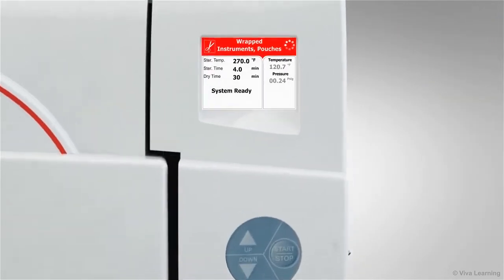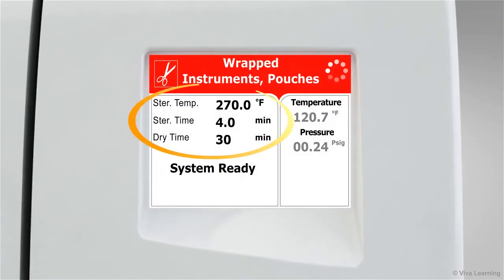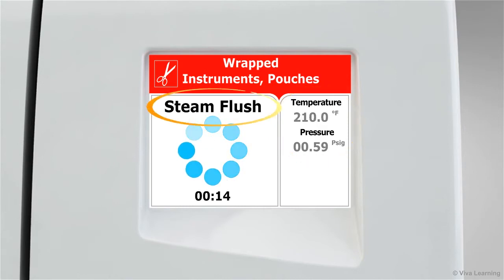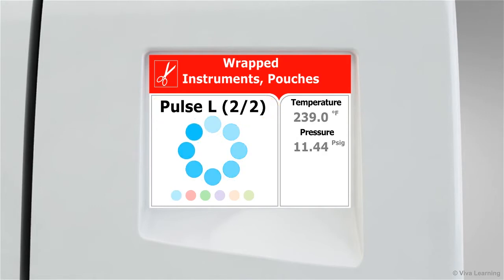All of the program parameters, including sterilization time, temperature, and drying time, will be displayed. Then, when the program is running, keep an eye on the display panel. The actual temperature and pressure in the chamber, as well as the current stage of the sterilization cycle, will all be clearly indicated. And, with each stage represented by a different color, it's even easier to get useful real-time information at a glance.